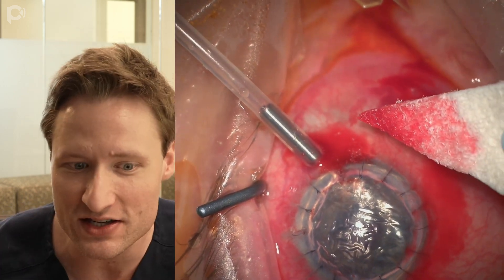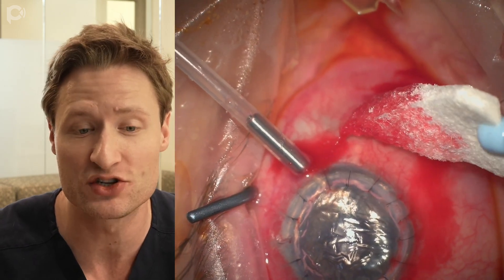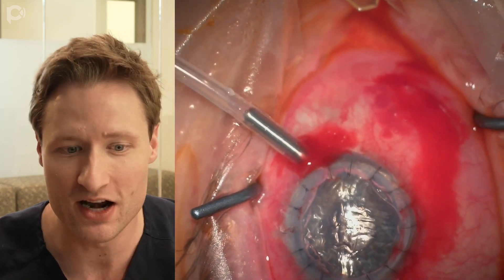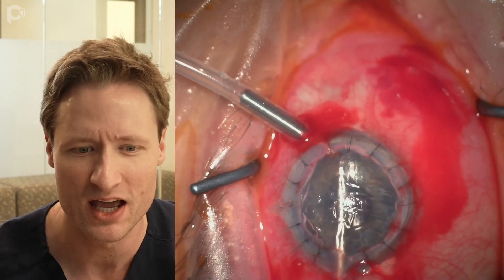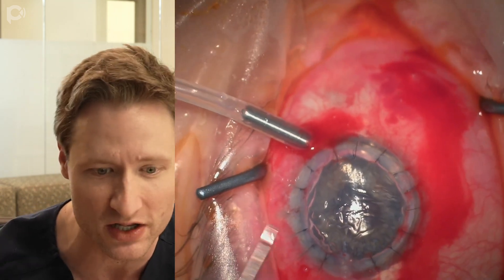We're lucky in this case because sometimes when you place an AC maintainer through a scleral incision you get ballooning of the conjunctiva with air. If that occurs — you get this fluttering air underneath the conjunctiva — you just make a little incision in the conjunctiva and that allows the air to be released.